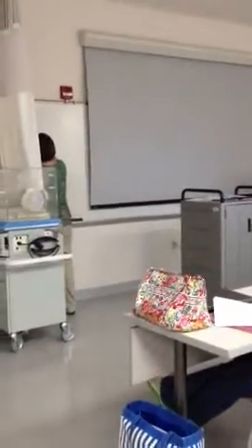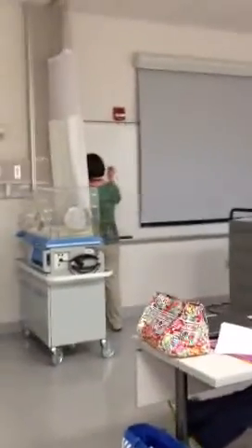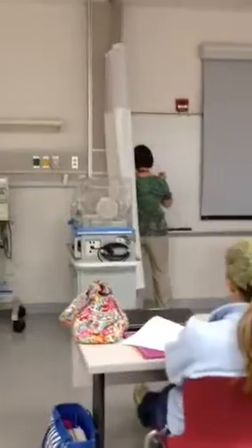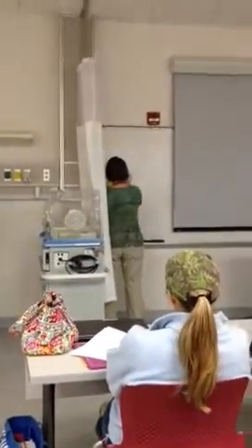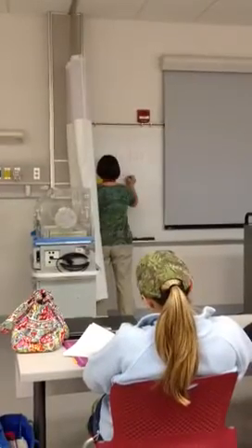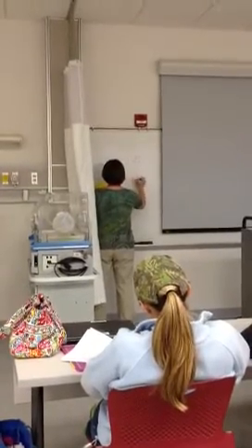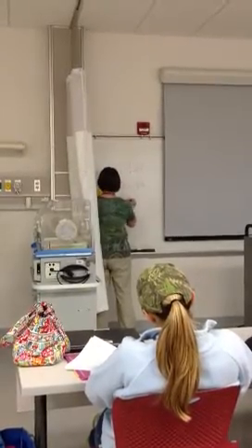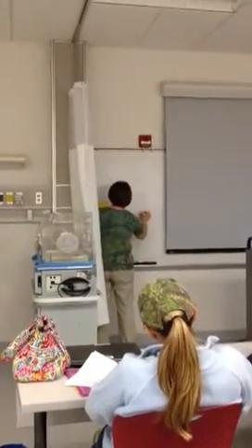I write it big so you can see. The pH is 7.28. I'll write them all down, then we'll go over them, okay? CO2 is 85. PO2 is 68.